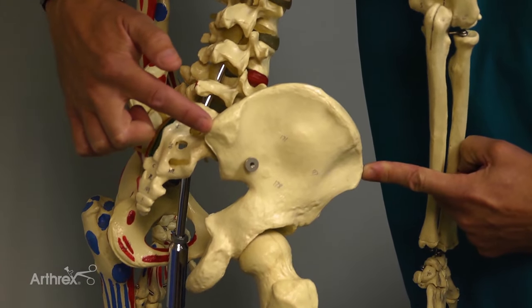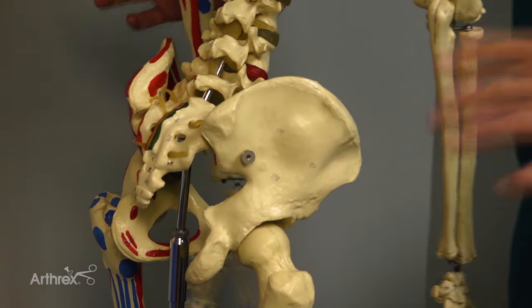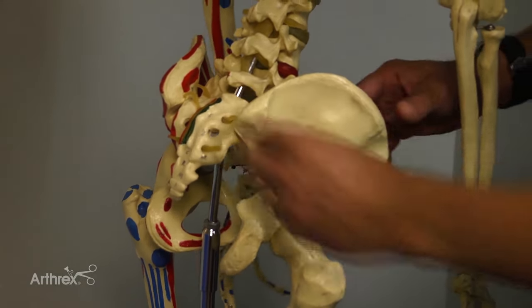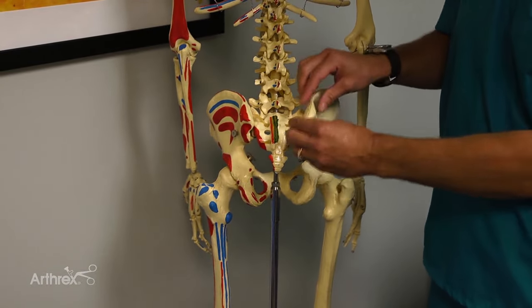The other thing I tell people is when you get your landmarks with your ultrasound and you numb this up, the biggest thing to make sure they don't have as much pain is you want to lift the periosteum from the bone. Make sure you numb the periosteum if you want to make your bone marrows fairly painless.